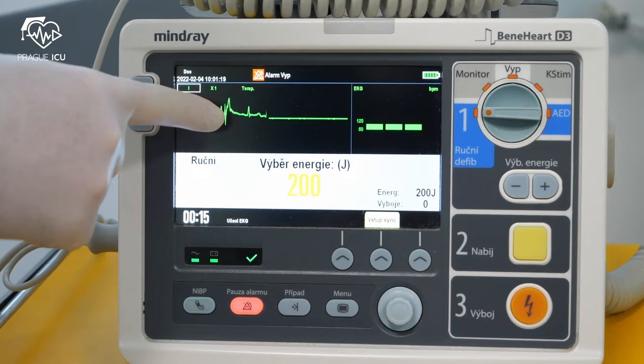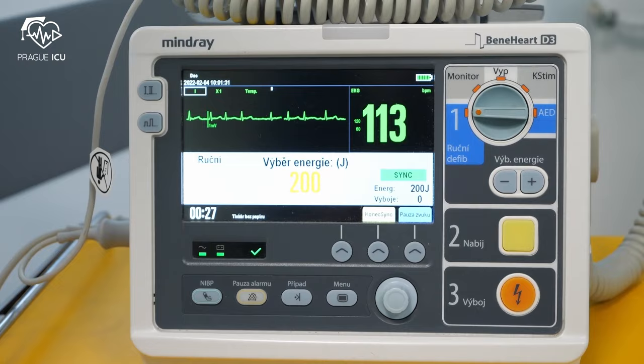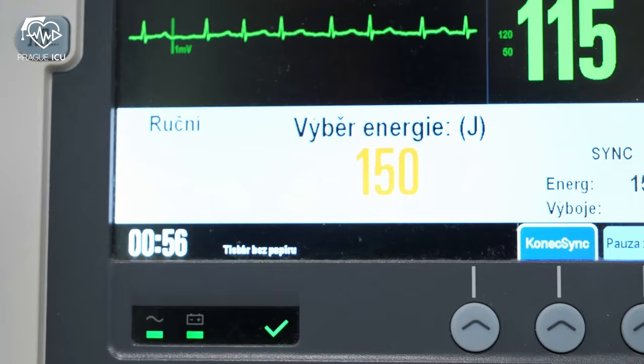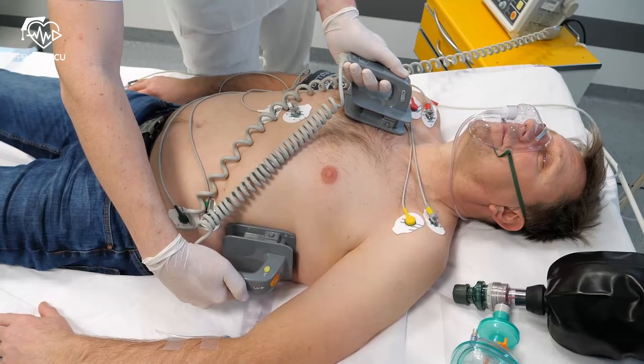Set up the defibrillator: enable ECG synchronization and set shock energy. Use at least 150 joules for atrial fibrillation.